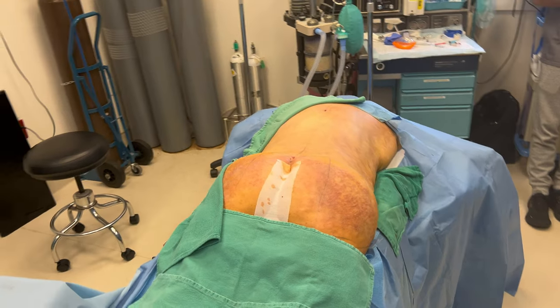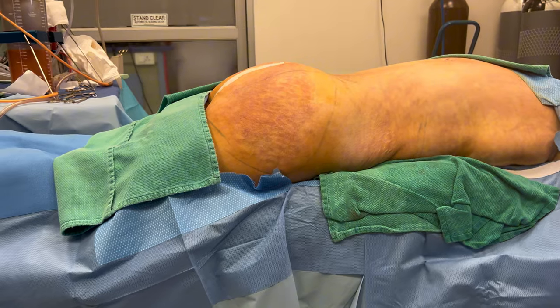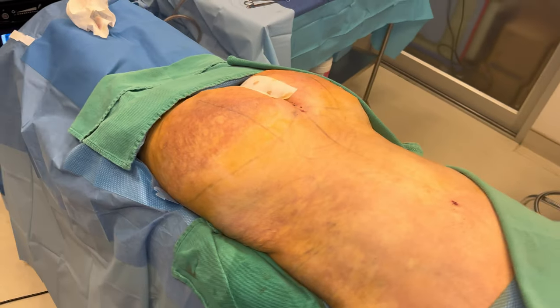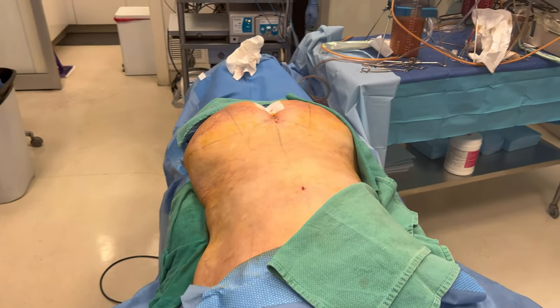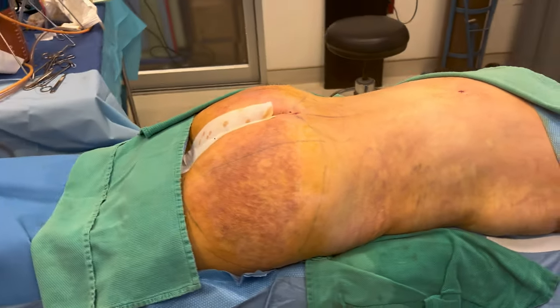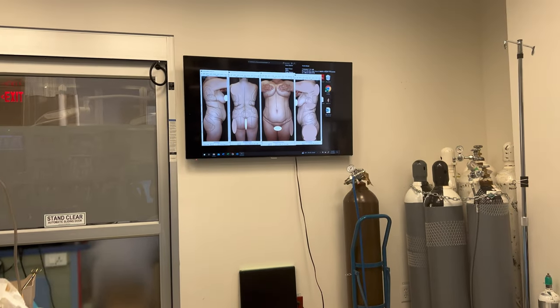And we are done. I just put about 800 cc's in her butt cheek — that is all I could do. I just could not squeeze any more; her butt is really tight. That's one of the limiting factors when you do Brazilian butt lifts: you need to understand there's only so much we can squeeze in. If the skin is not expandable, there's just no point in squeezing more fat — it'll just get too compressed. So we can only fill up as much as the butt can handle.